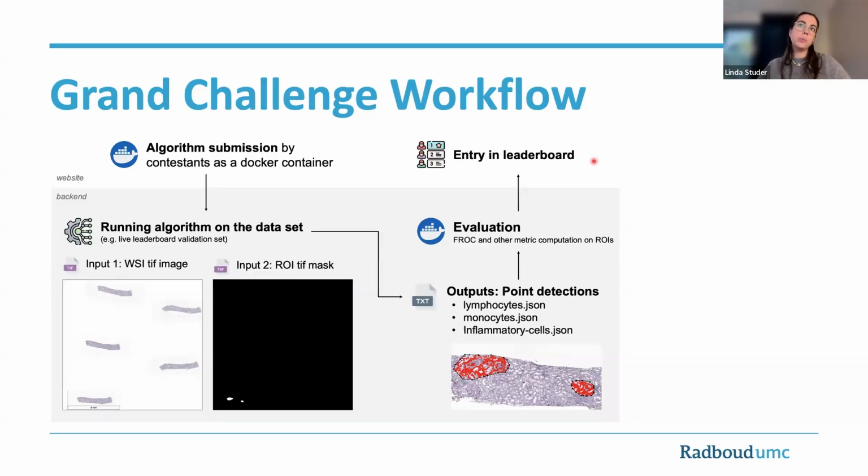And in our case, we also provided them with some additional output files so that they could plot the FROC curves themselves just to look at them, because Grand Challenge at this point doesn't support images being directly uploaded to the leaderboards. Yeah, so this is the workflow that you will be working with if you ever want to run a challenge yourself.